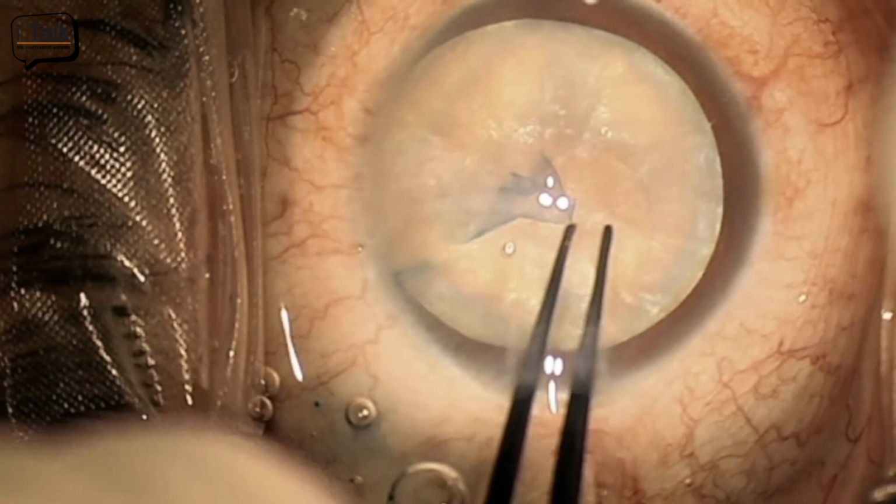I think there were three mistakes in this. First of all, if you see the center, there is some concavity in only a minimal part, which showed that right in the center, the intralenticular pressure was low. The first mistake I made in this patient was that I took the flap while creating the rhexis into the area which had high intralenticular pressure.